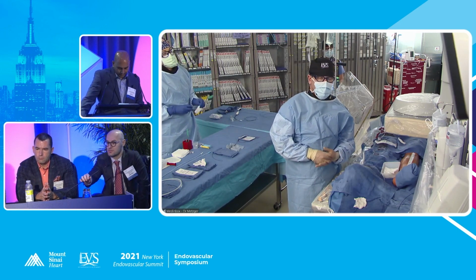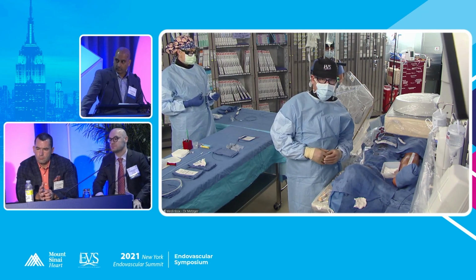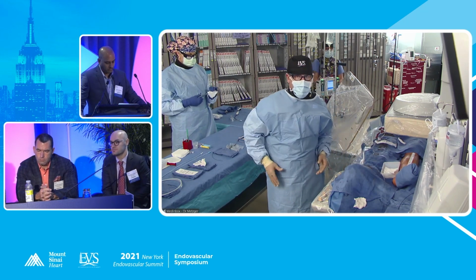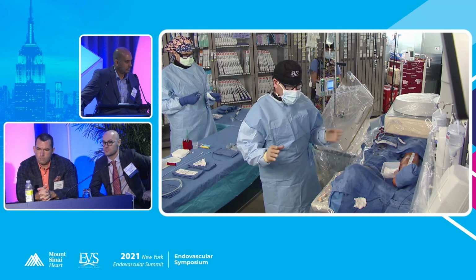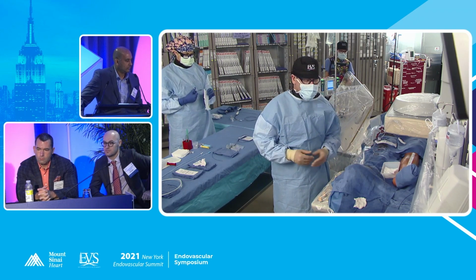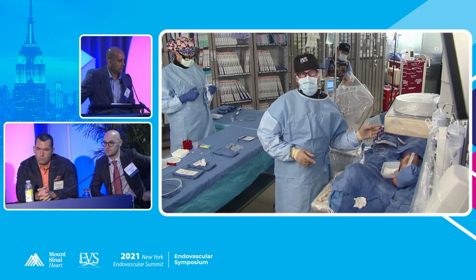Yeah. Okay, great questions. First of all, as I said, it had been 4 months, and we already had a duplex with an ABI of 0.92, and I looked at the duplex of his right common femoral artery, so it was okay. So 4 months later, I felt completely okay with accessing it. With that degree of calcium, I'm not going to use a closure device.